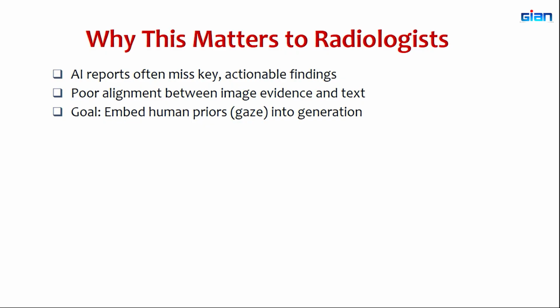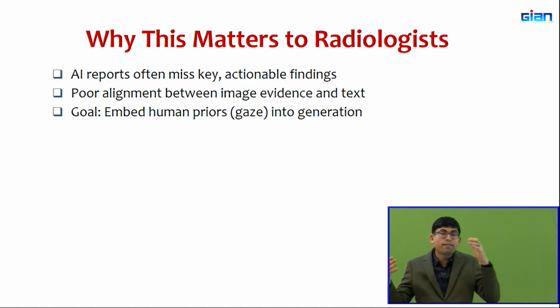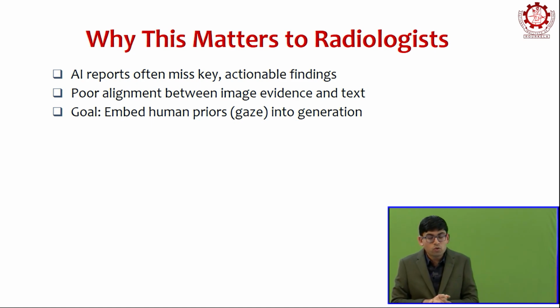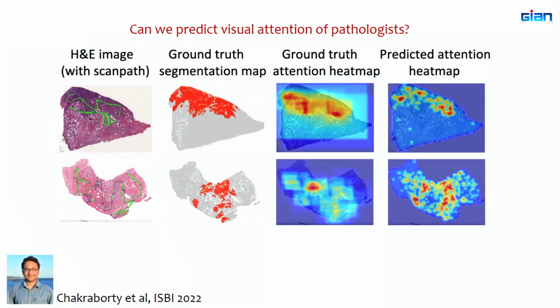So if you can use gaze to ground the report information and the image information, it gives you a richer source of information compared to just image and text alone. So the goal is to embed these human priors in the form of gaze into the generative framework.